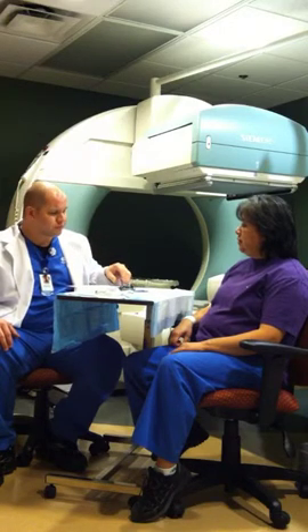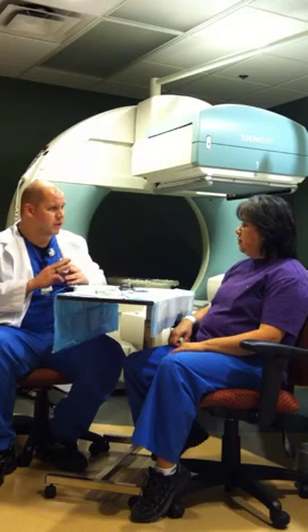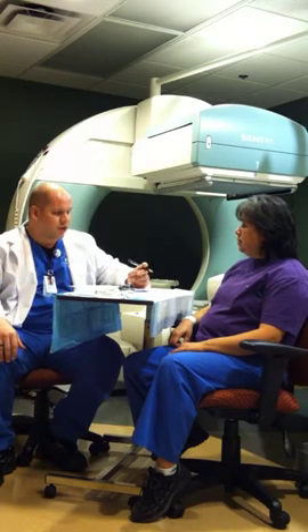We won't really be able to see anything while we're acquiring the images. The protocol — a lot of hospitals do three different views. They'll take a left anterior oblique view, just sort of a diagonal view on your left side — that's the image that gives the calculations for your ejection fraction. Then we'll do an anterior picture for a few minutes and then a lateral view from the side, so the doctor will have several views of your heart. We're looking at about 10 minutes per view, so about 30 minutes of imaging total.